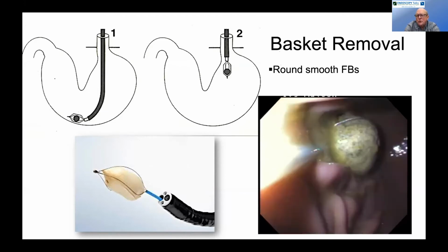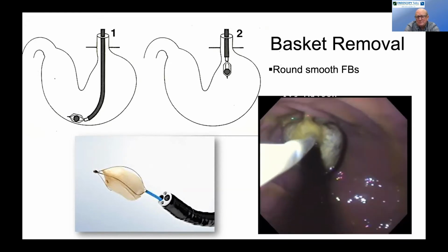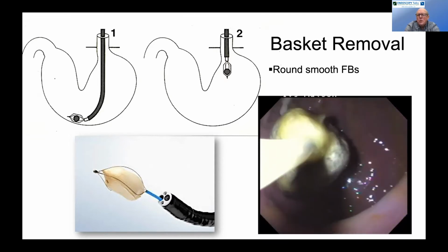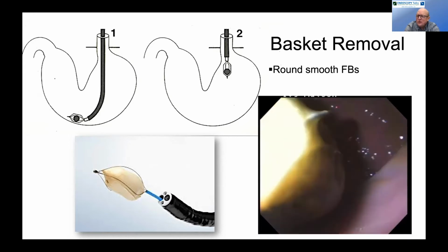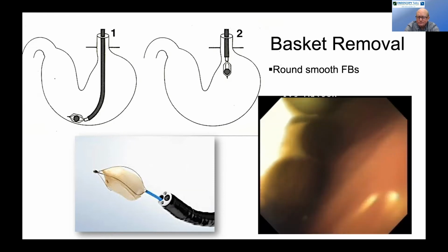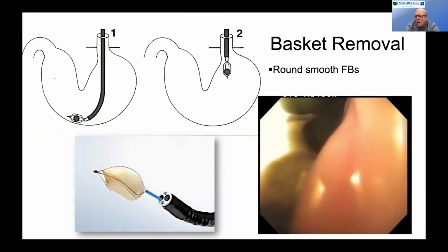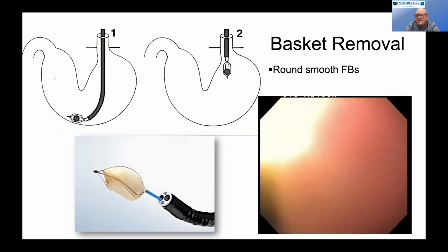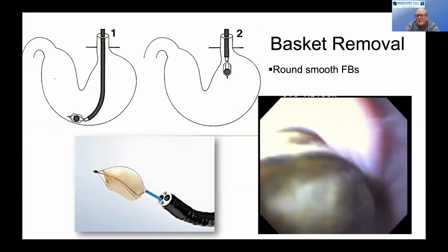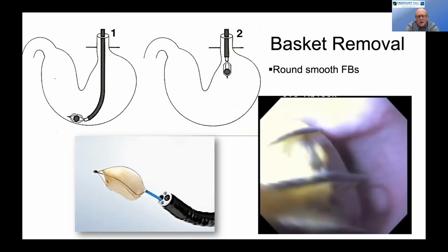Once you've been able to grab your foreign body, and I'll do this for cloth material, little stones as shown in this video, once you get a good hold on it, usually those you can easily pull through the lower esophageal sphincter and into the esophagus. So here we are backing it up. And in this particular case, we had to put quite a bit of pressure to get this through the distal esophageal sphincter. So I'm right up at the sphincter now. I'm pulling quite hard. I'm pulling and pulling, and then pop, the foreign body gets into the esophagus, and then usually you can very easily retrieve it from there.